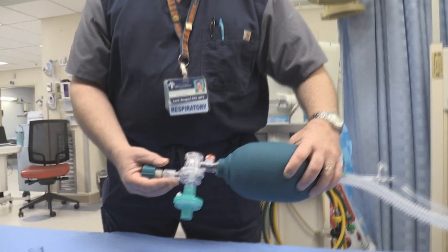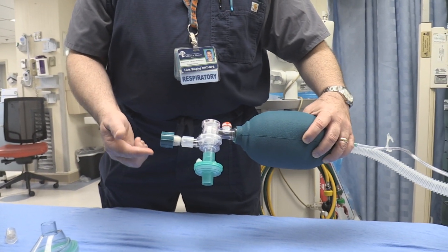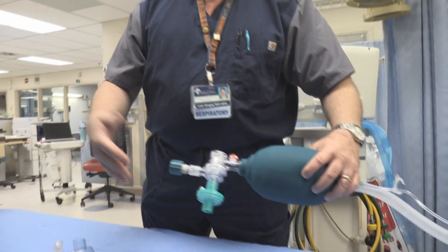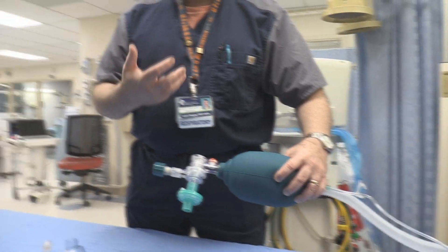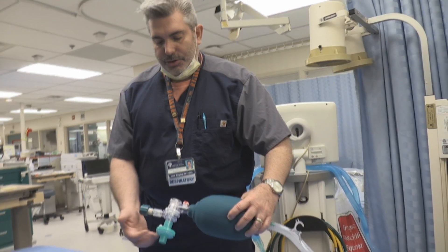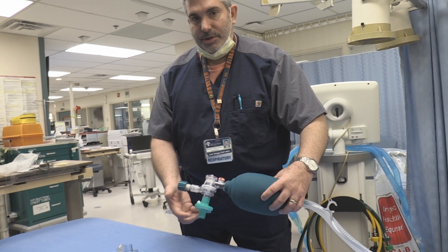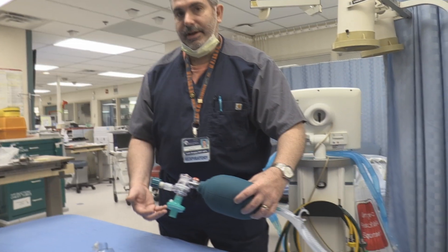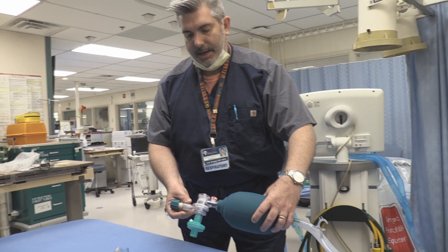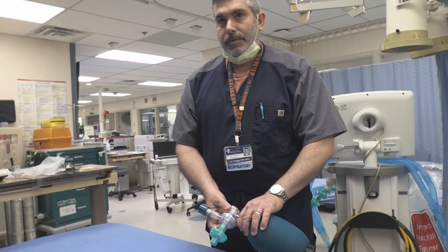One thing to be aware of and cautious about: if you have a patient with a lot of secretions — a lot of times when you intubate a patient you get secretions coming back up the ET tube, or if trauma is involved you may have blood — you don't want those secretions entering the filter because that would create an obstructive effect. You always have to watch that filter and make sure it doesn't become occlusive. If it gets wet, it's going to interfere with airflow.